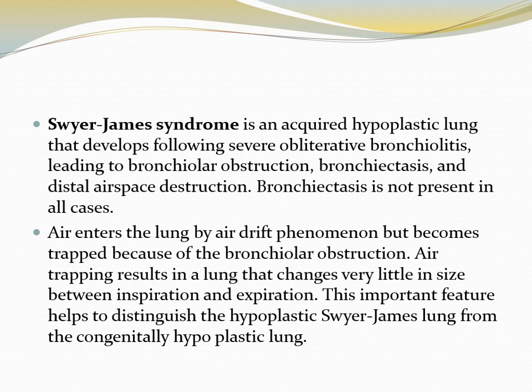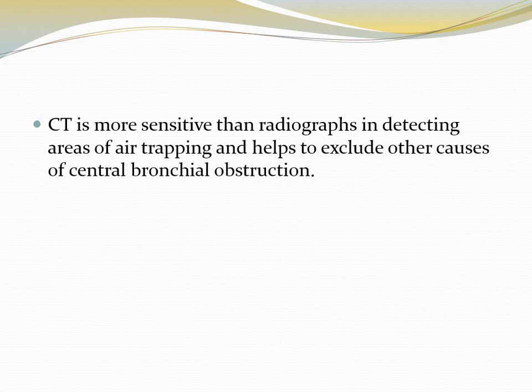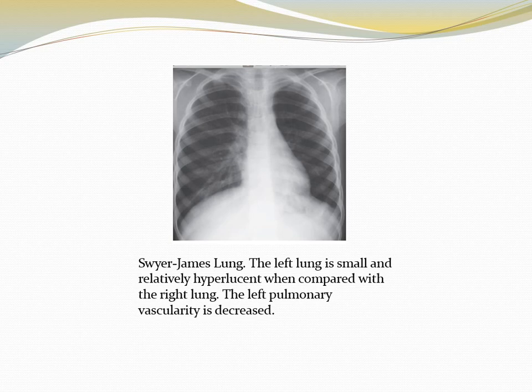Bronchiectasis is not present in all cases of Swyer-James syndrome. Air enters the lung by the air drift phenomenon but becomes trapped because of the bronchiolar obstruction. Air trapping results in a lung that changes very little in size between inspiration and expiration. This important feature helps to distinguish the hypoplastic Swyer-James lung from the congenitally hypoplastic lung. CT is more sensitive than radiographs in detecting areas of air trapping. In this case, there is a small, relatively hyperlucent left lung with decreased left pulmonary vascularity. In Swyer-James syndrome there is decreased volume and increased lucency.